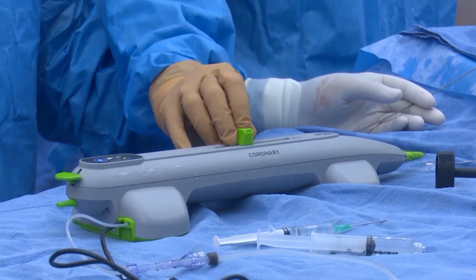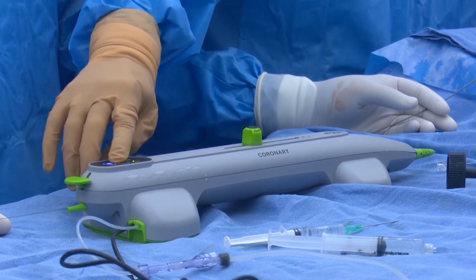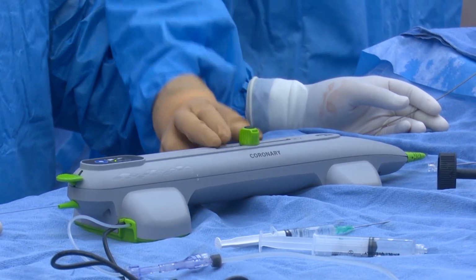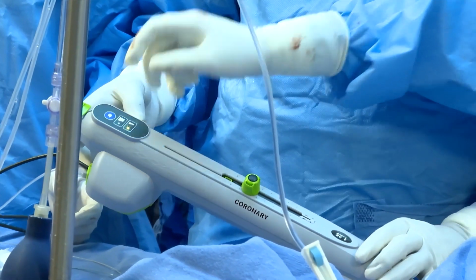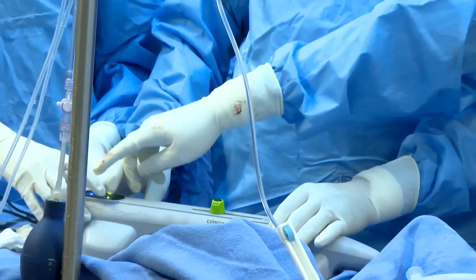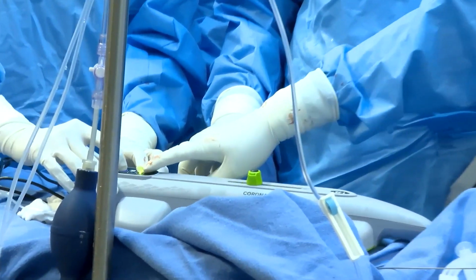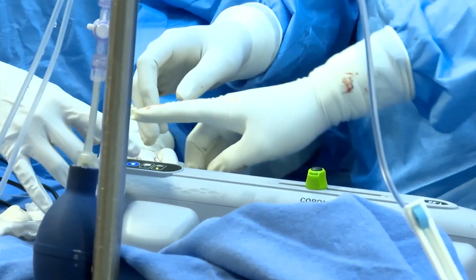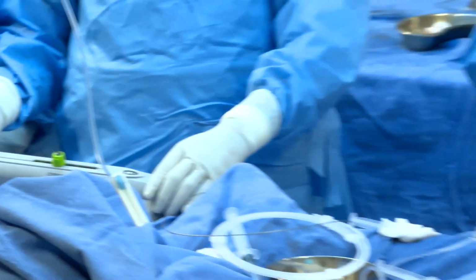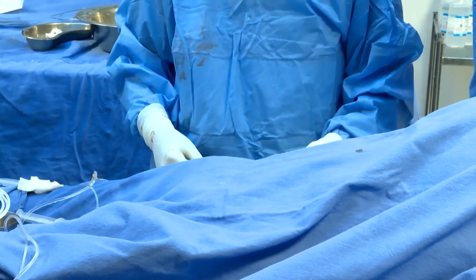When you want to start the orbital atherectomy, turn this angle and press it, move it. Once you press it, there is locking and unlocking of the burr. This is the 80,000 and this is the 1,20,000 speed. So if you want high speed ablation, 1,20,000. This is 80,000 revolutions per minute. So this is the glide mode. While placing the orbital atherectomy inside the catheter, you can put the dynaglide.